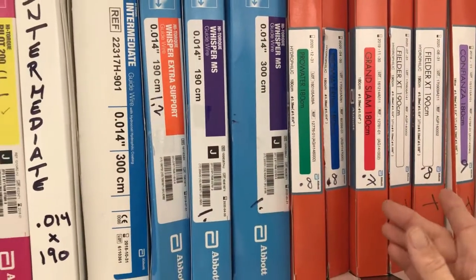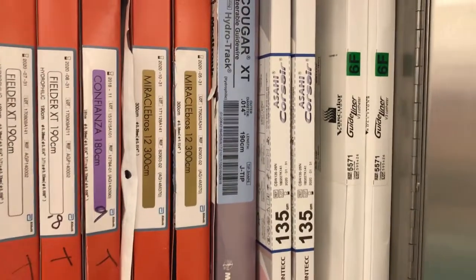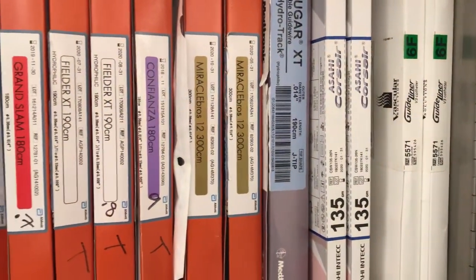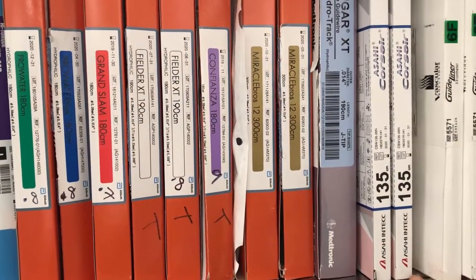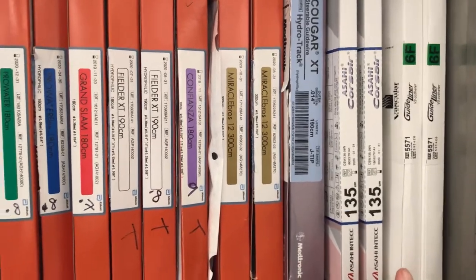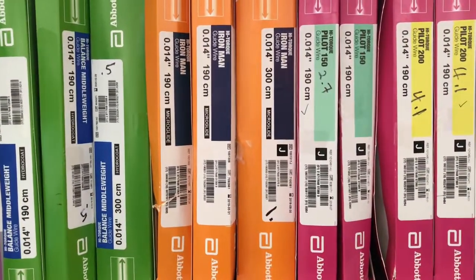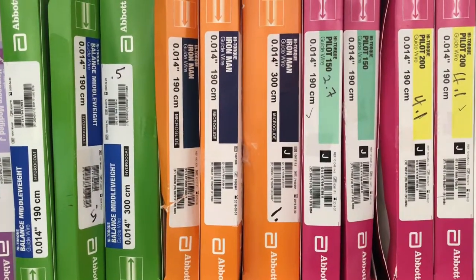To the far right are your microcatheters — your Corsairs — that will help support any wire that you're delivering in coronary anatomy. And to the far right is the guideliner, which will help give you more guide support inside your guide. Now I'm going to talk about the escalation of your wire choices.